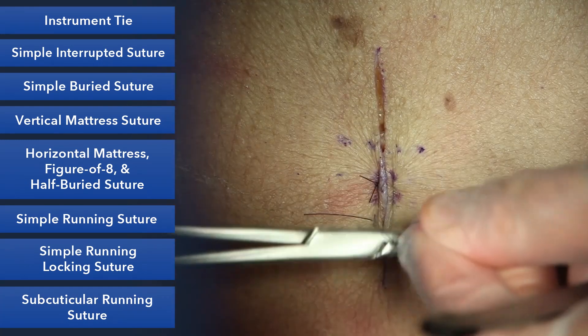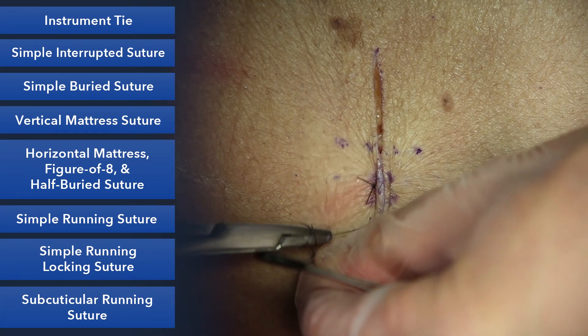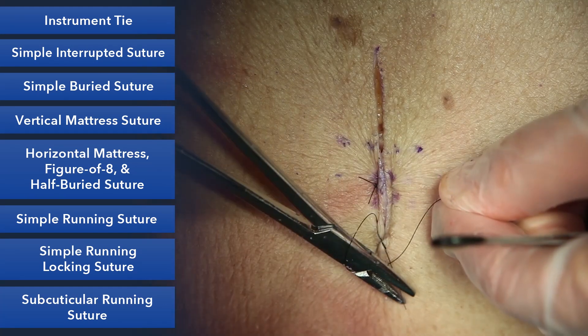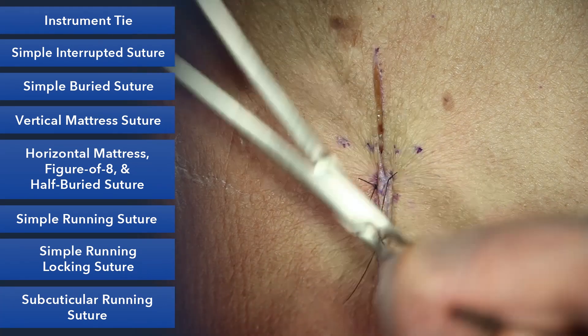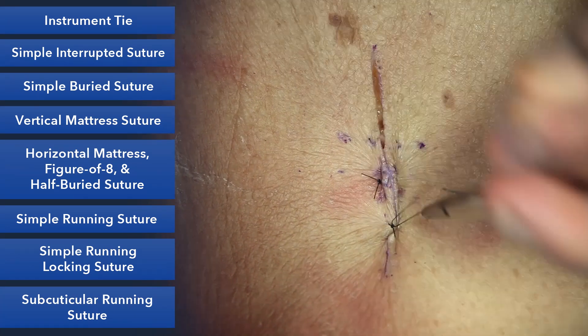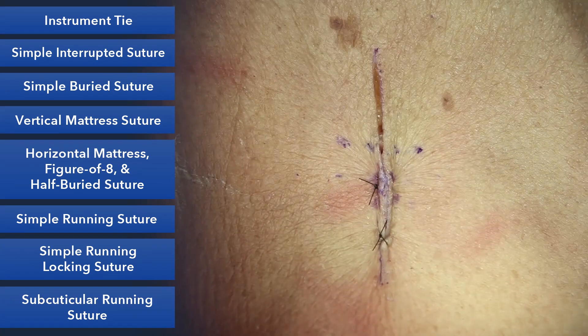The advantage of this again is speed. Instead of doing two simple sutures and tying two simple sutures, you'll see this sometimes in deeper closures like fascial closures, because you're grabbing a bunch of tissue to a bunch of tissue and therefore it'll be more secure.